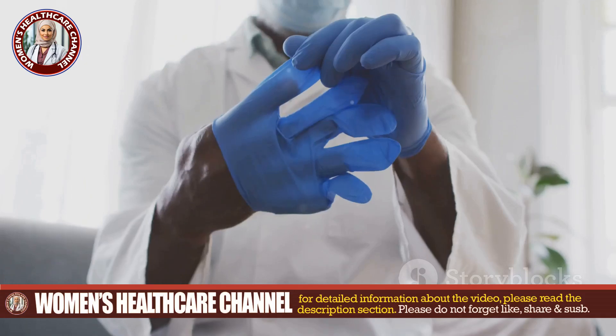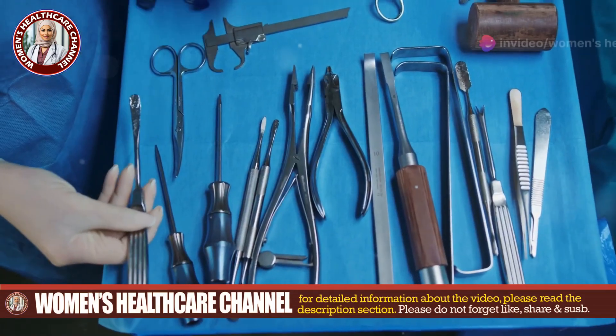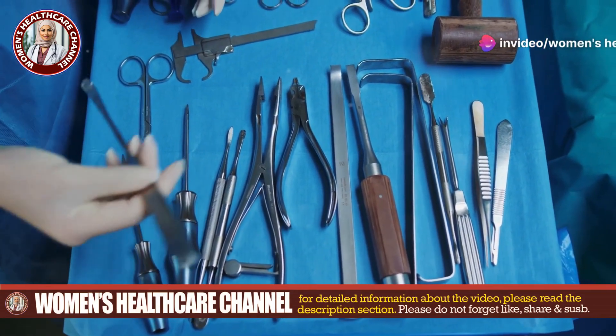First, gather your materials: sterile gloves, saline, tweezers, a needle, gauze, and antiseptic ointment.